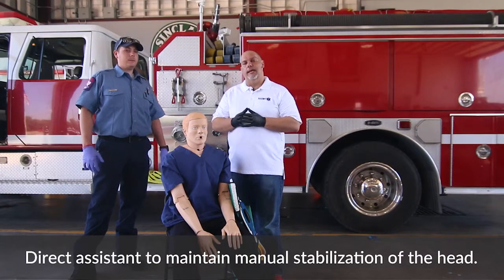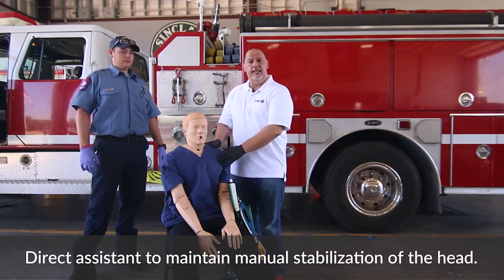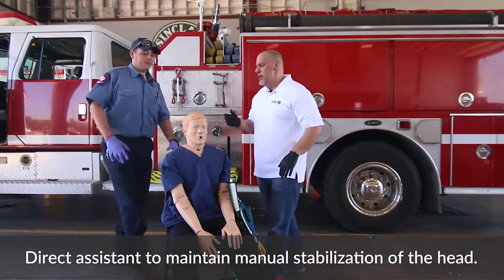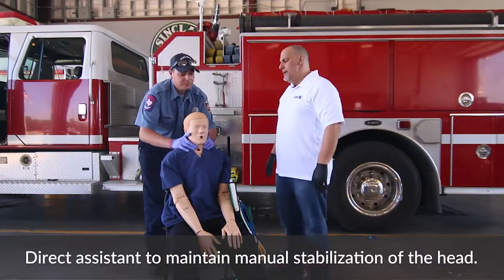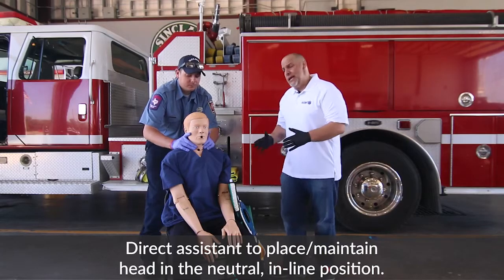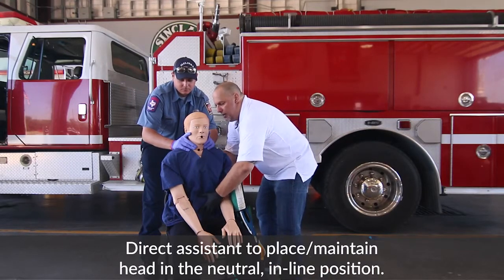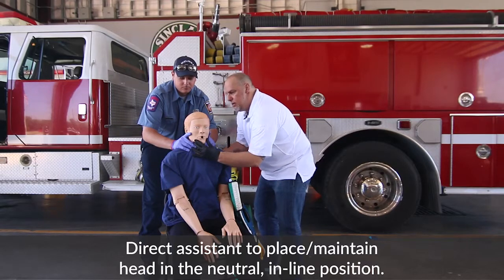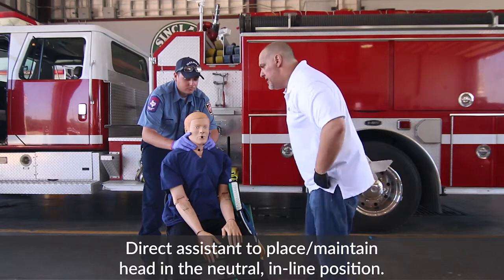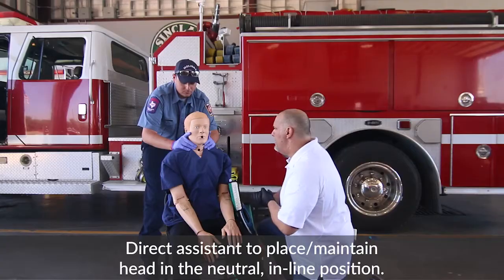When it comes to putting on a KED, you could be utilizing this inside a car or with a patient that is seated, as you see here today. So what we're going to do first is take manual inline stabilization — I'm going to ask my partner to do that. I want to make sure that the patient is as straight, stable, and inline as they can be. Everything that you're doing, you want to make sure that you're talking to the patient and describing everything that you're going to be doing to them.